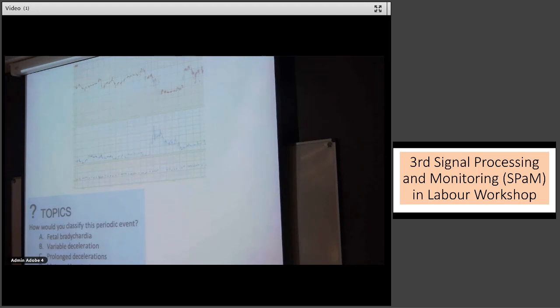You can change the cardiac axis of the baby, first of all, during a contraction. Who's done that? Somebody here? That a contraction changes the vector. It also can change dramatically the noise ratio between the fetus and the mother. So if you have a high maternal signal and a low fetal signal, even on an electrocardiogram, you can see it.